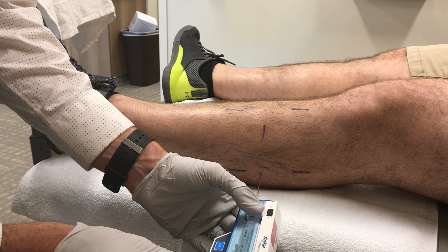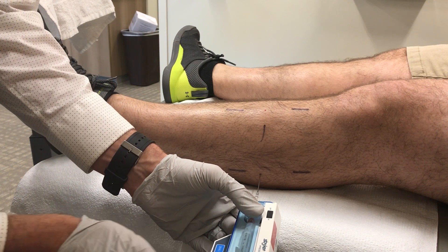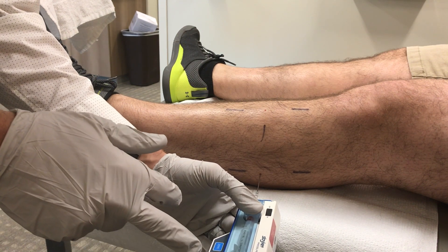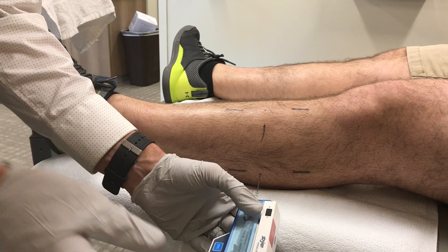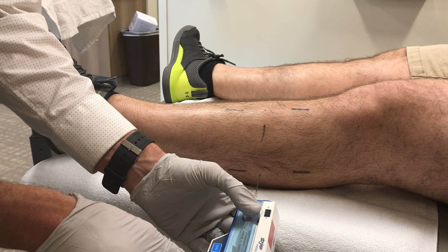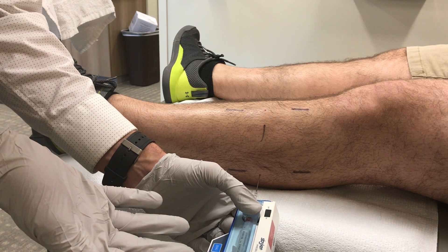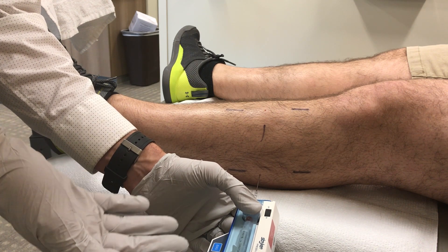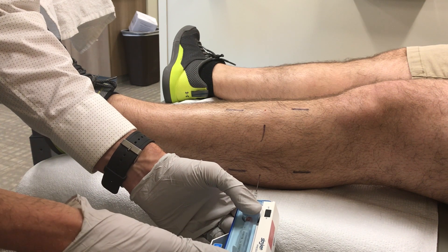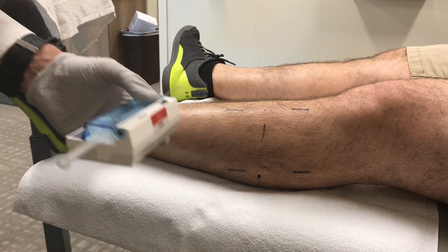Push just a small amount — less than half a CC of fluid — and then wait for the pressure to even out. It'll likely shoot up high initially, then lower down. He ends up at about 9 mmHg for the lateral compartment, so we'll record that.